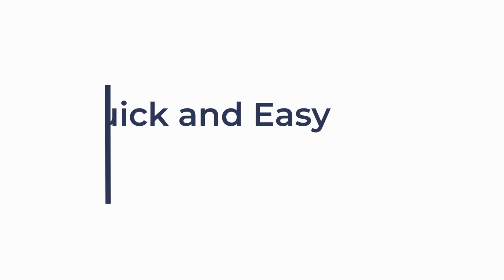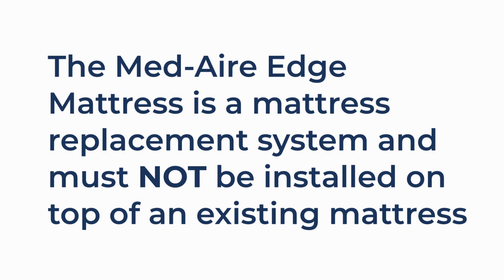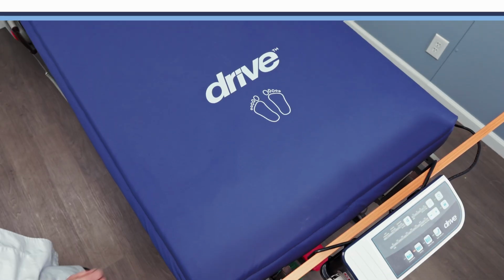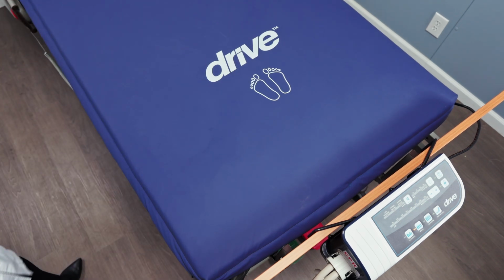It's quick and easy and no tools are needed. The Preserve Tech MedAire Edge mattress is a mattress replacement system and must not be installed on top of an existing mattress. First, place the mattress on top of the bed frame, noting the Preserve Tech MedAire Edge foot end.